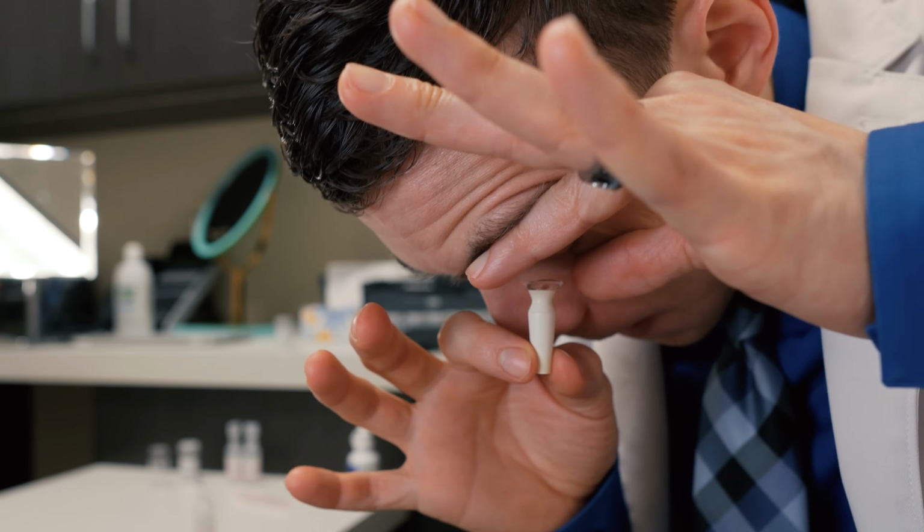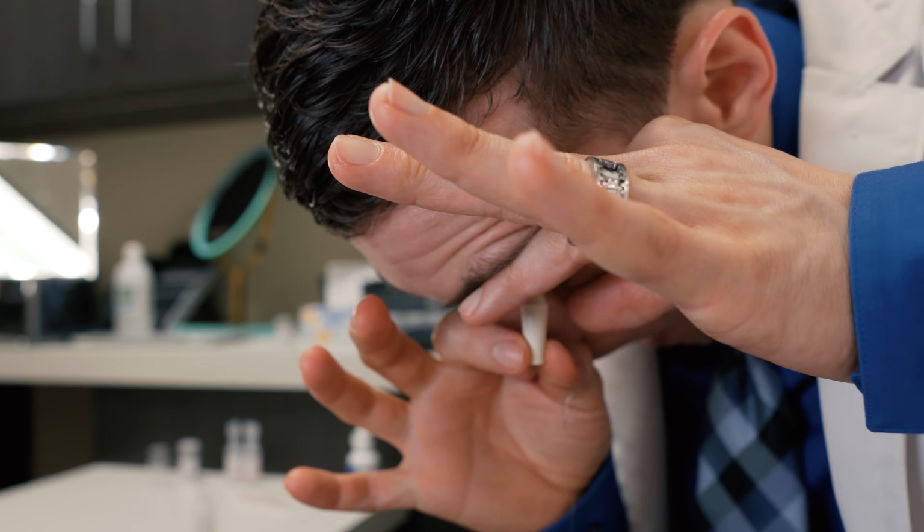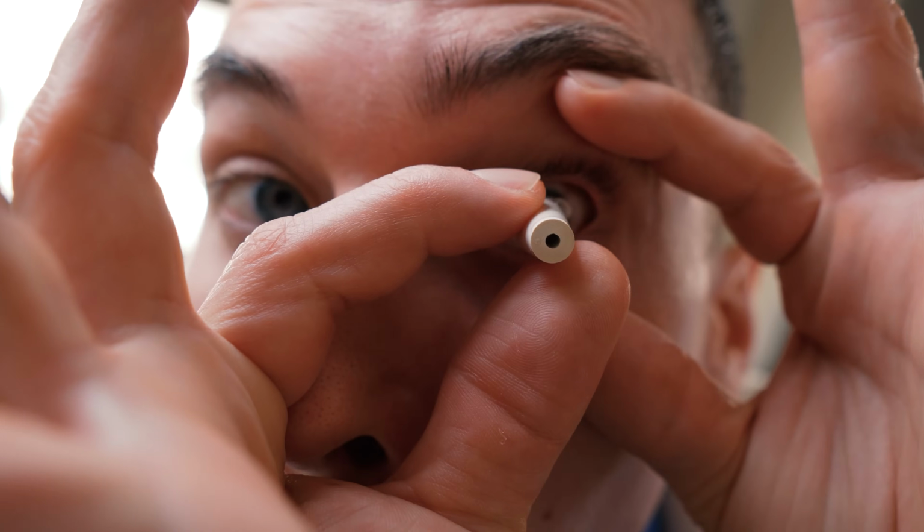Another pro tip is to keep both eyelids open during this whole process. As the eyelids are open wide, push the lens onto the eye while staring straight down toward the floor. The lens will gently suction onto the eye and into place. Naturally, some of the saline solution will be displaced and spill out of the lens, so expect it to be a little messy. Don't be afraid, this whole process can take a few tries if you're just starting out.